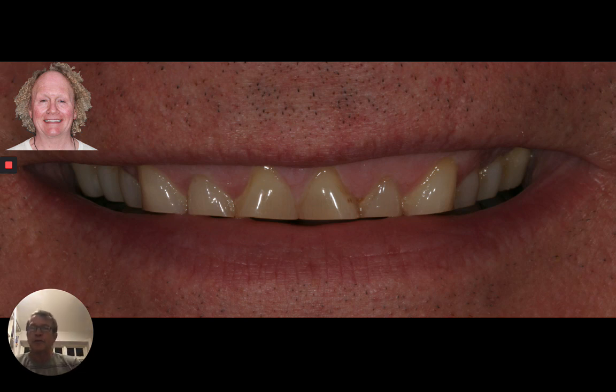We're also going to talk a lot about how we could maybe control this patient's function. So if we're going to do that, then we'll need to make a splint, and splints have always been a bit of a nuisance for all of us, I think. So we're going to show you how in the digital world, working with your technician, you can design and print or mill a splint really quickly and efficiently. That's going to fit great, work tremendously for you to stabilize the patient's bite so that we can then move forward with the aesthetic part.